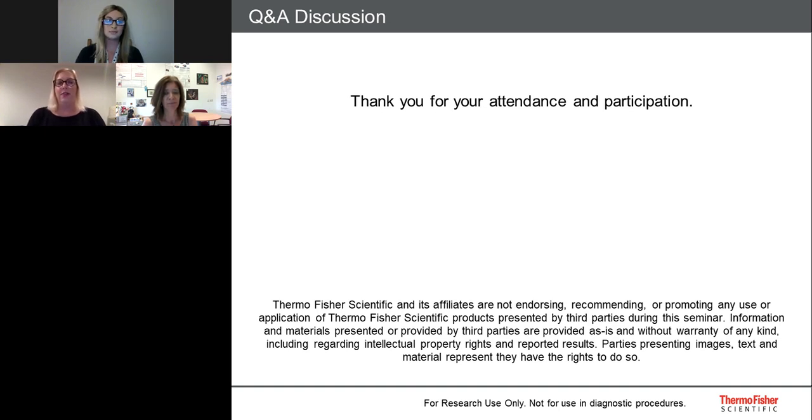Is it okay if I just answer that question? Absolutely. So I would say, in our experience, when we're looking at copy number bioinformatically, we're comparing to other samples within that run. So anything that's not well covered across all samples, like you mentioned, exon 1, is difficult to pick up bioinformatically. Additionally, small deletions, so 1 or 2 exons, are also equally difficult to pick up bioinformatically. So the beautiful thing about the exon array is that you're really looking at that specific patient, or that individual sample, and those probes are specifically designed to cover those exons.